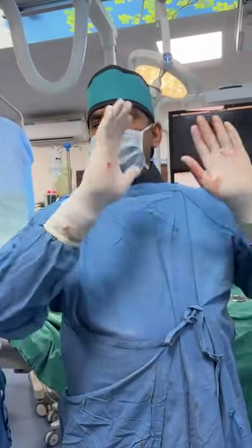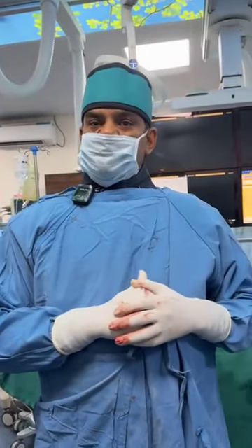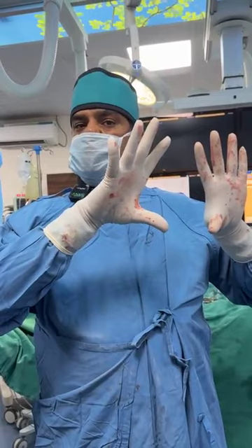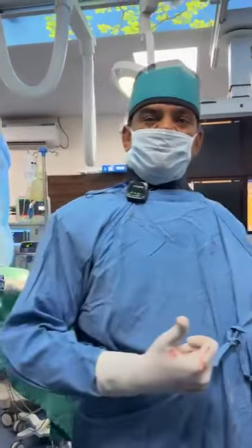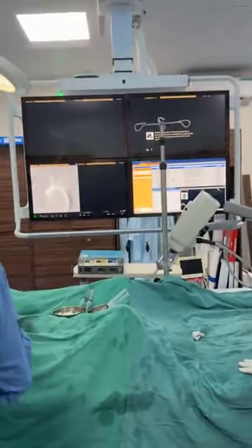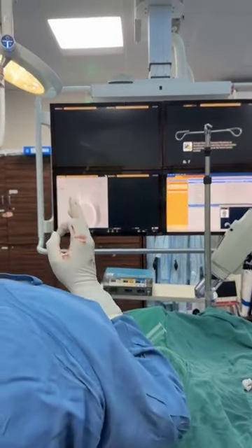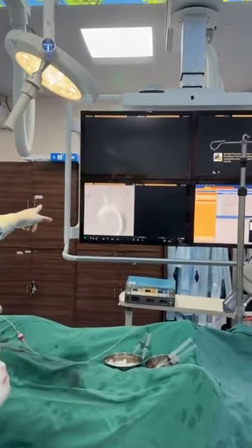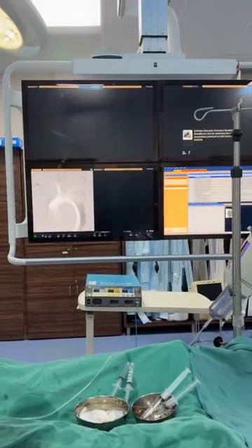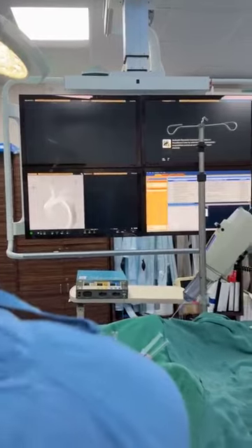Now, for example, during taking of the mask, we have injected the contrast because of the auto connect of this injector. Then the contrast will also be identified as native, and it will also be negativized. So this is what is happening. The injected contrast before the mask was taken looks white, and after the mask the contrast looks black. So this is getting us a very beautiful picture of which is a true lumen and which is a false lumen. Because we have injected previously, now the true lumen is seen as white, the false lumen is seen as black. Okay. So that is the beautiful image we have got.